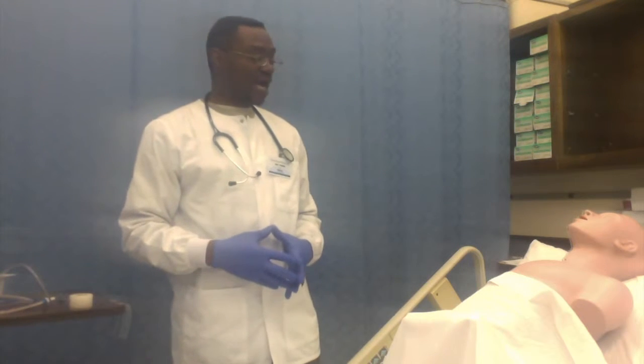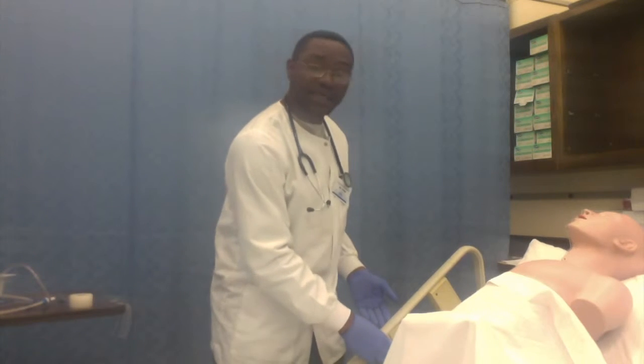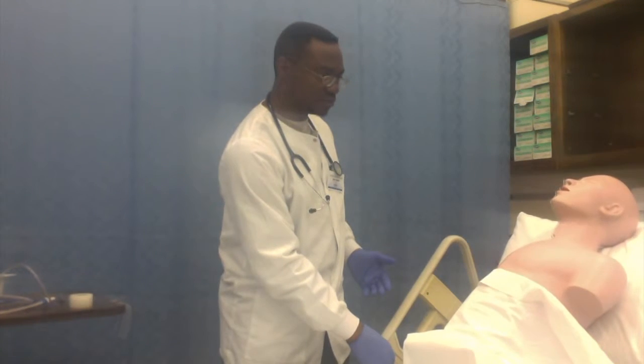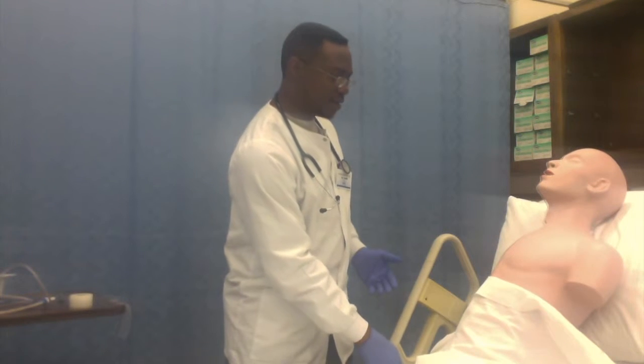At this moment, I will want to position my patient. So I will take up my bed to waist level and make sure that the patient is properly placed in a high Fowler's position. Good. Being in a high Fowler's position, this minimizes any risk of a reflux action during the procedure.